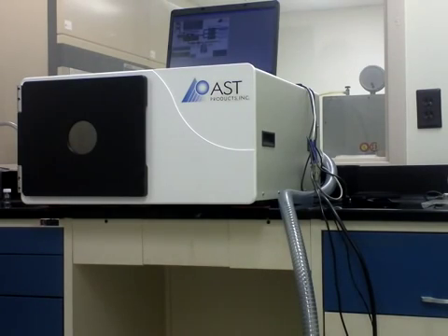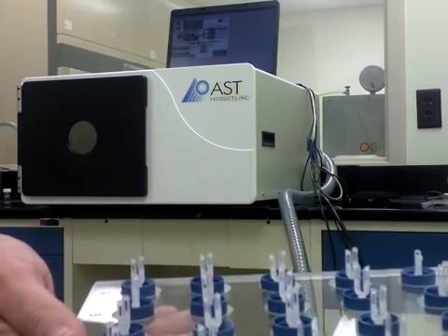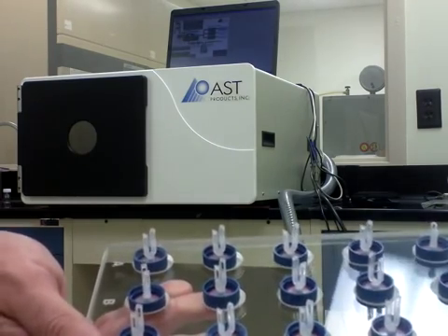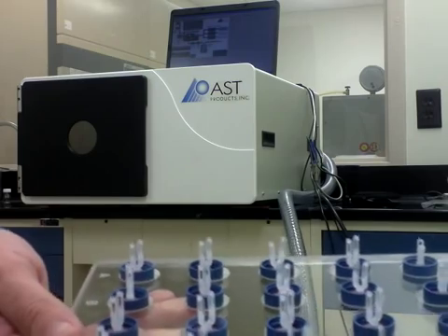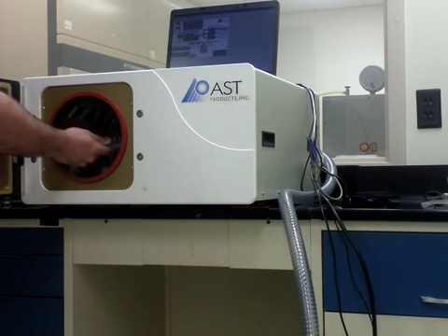Loading the PJ plasma system is very easy. You take the PJ tray that comes with the system, put the contact lenses onto the tray in the holders, open the door, and slide the tray in.